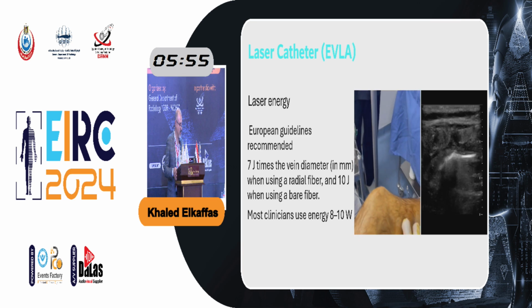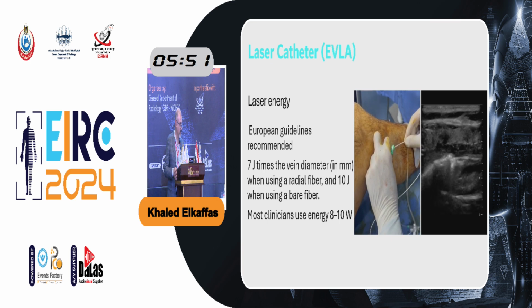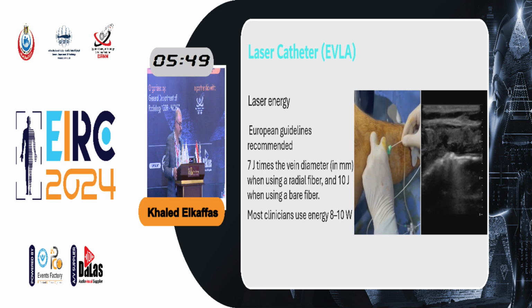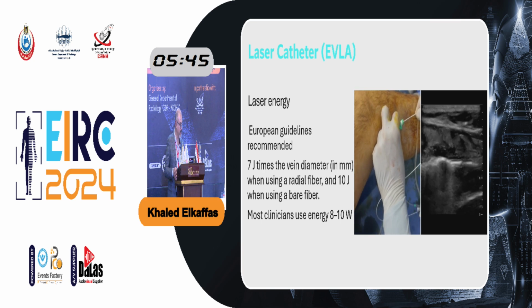Here's another machine of the laser. There is a steam formed by the laser beam to ablate the venous wall, and we can see here no perforation, as the steam doesn't go into the tissue surrounding the vein.